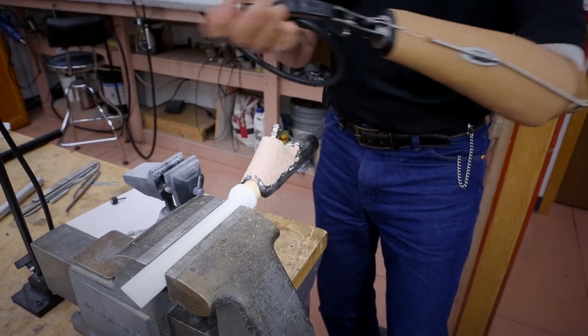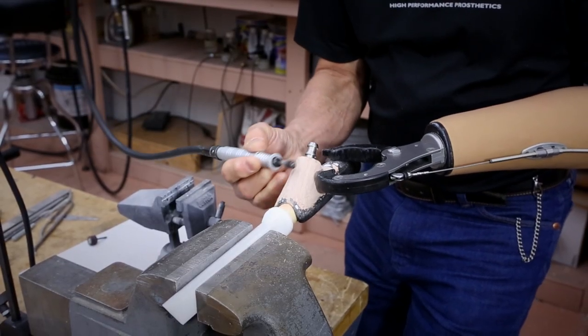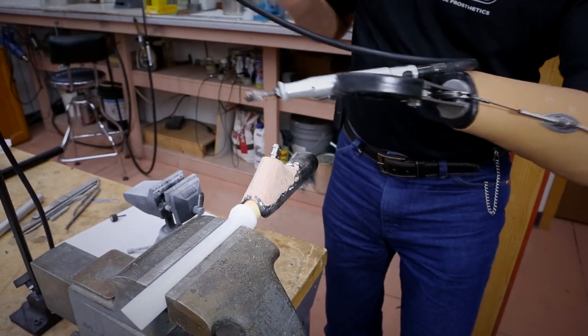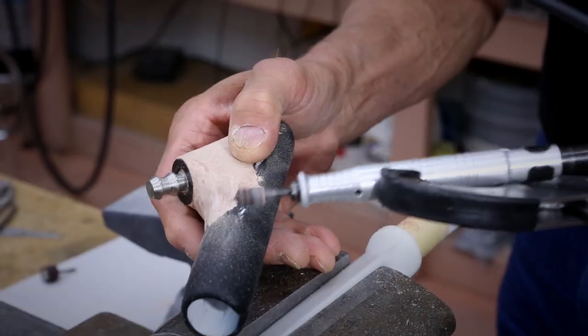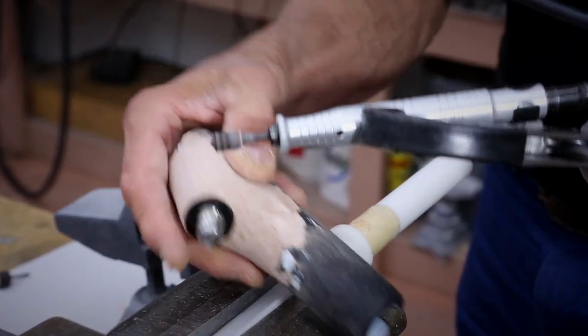Another thing I can do is use a different kind of tool. I can augment and use my regular hand to be doing polishing, but at the same time I've got the flexibility because of the grip terminal device to handle this with my sound hand and to be doing actual shaping where I can lock the tool.